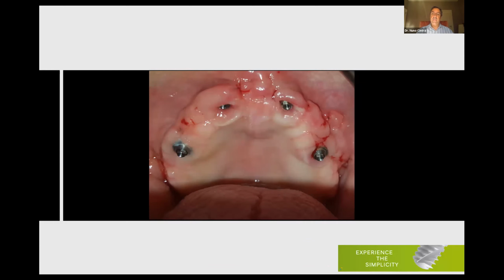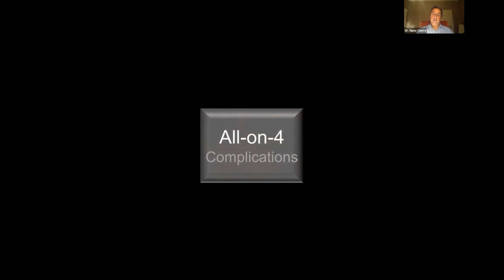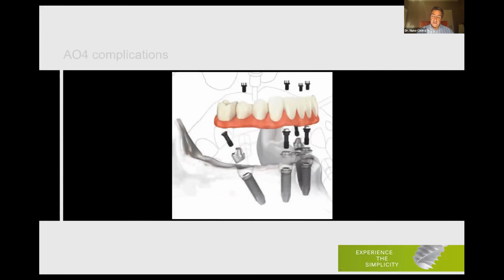Of course, as with all techniques, this is recommended for very atrophic cases. This is not a substitute for standard all-on-4. This is just for when we don't have bone. I can say that the custom implants can replace the zygomatic implants, in my opinion.